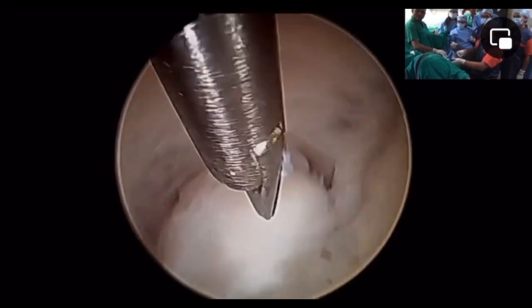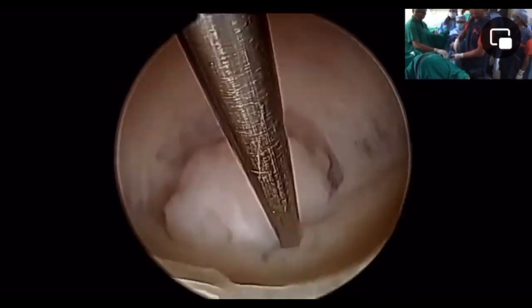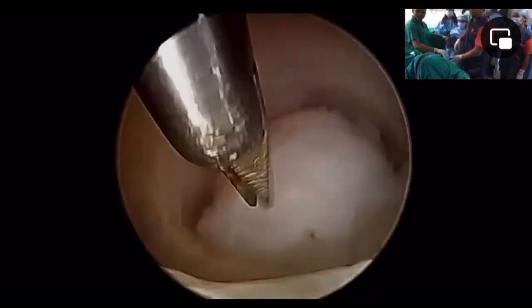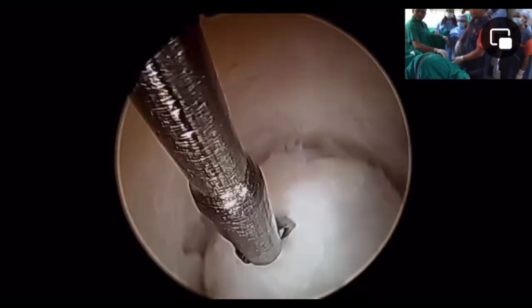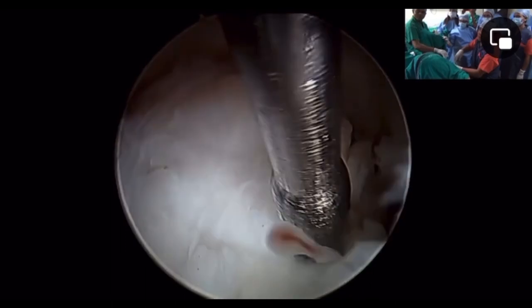And as you can see here, using the scissor helped me to dissect the myoma all around from 3 to 9 o'clock, passing by 12 o'clock. So anteriorly and laterally, the myoma is nicely dissected, freed from its attachment, but I'm now working on the more difficult part, the posterior part. So how to do it?